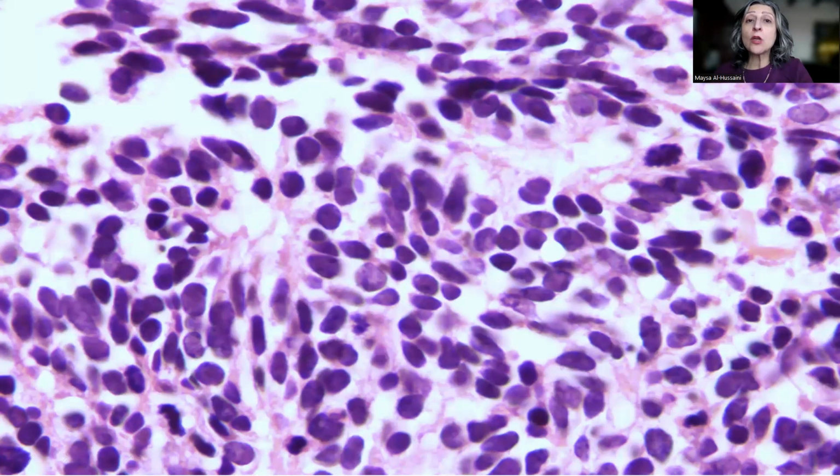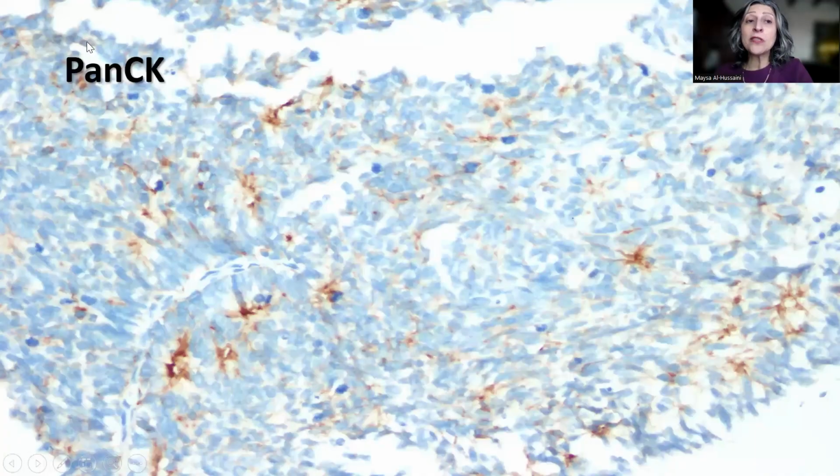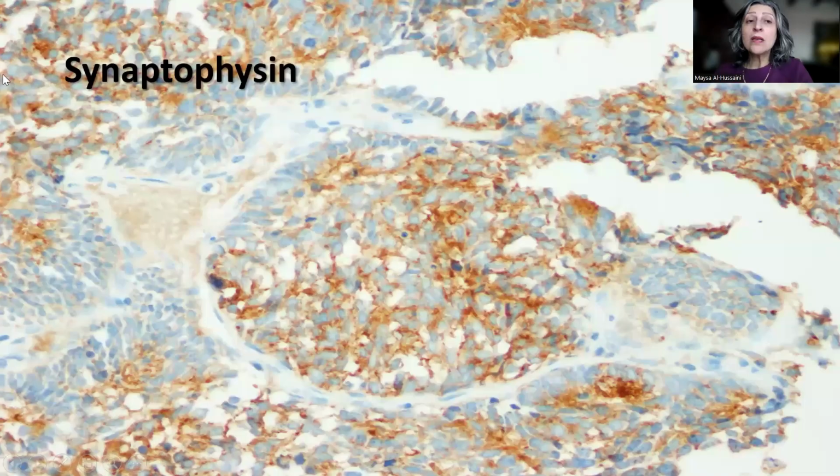The differential diagnosis is wide, but definitely this is not multiple myeloma, and we have to consider metastatic carcinoma. Pancytokeratin showed focal, not very impressive positivity, but definitely it was positive, showing a dot-like cytoplasmic positivity, which points towards a neuroendocrine type of carcinoma.